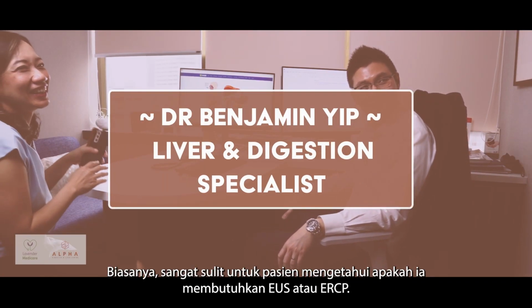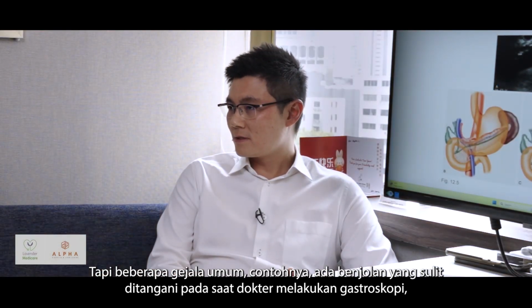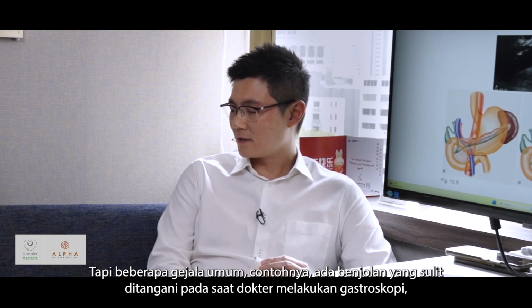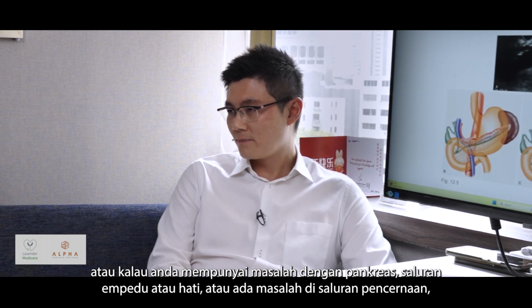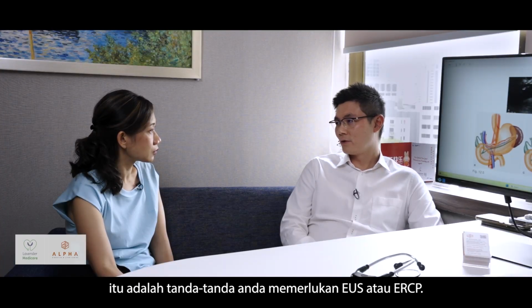Usually it may be difficult for a patient to know when he needs an EUS or ERCP, but a few common things, let's say when you have a difficult lump, when a doctor does a gastroscope, or you have a problem with your pancreas, your bile duct or your liver, or you got a problem in your plumbing, then that's when you know you may need an EUS or ERCP.